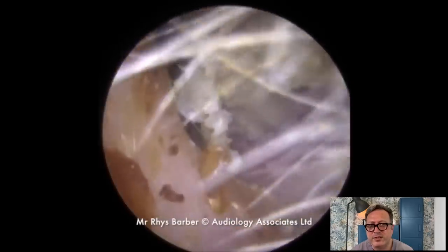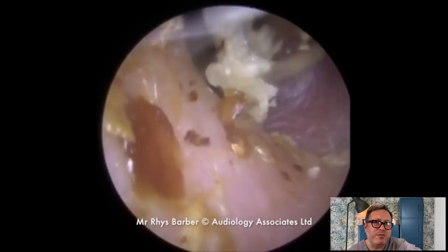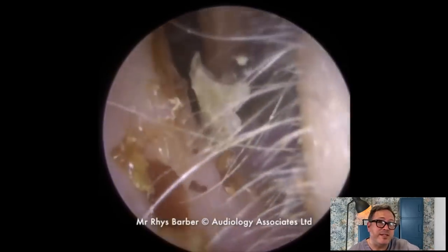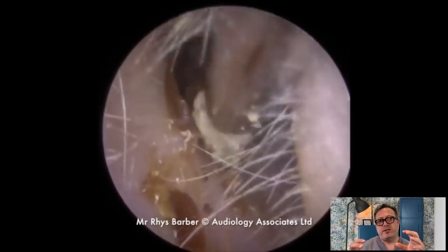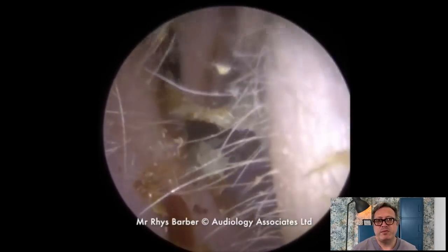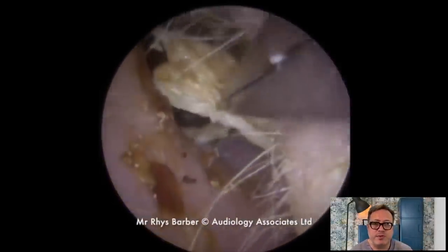You do get quite a lot of degradation to the skin around that area. It looks like it's not too bad there, looking underneath. You can see just how much of that dead skin layer is there — how thick that layer is. The pink is the canal wall itself; the white layer we've just taken away is just dead skin sitting on top of it. But now we've got rid of a lot of this material, it means the natural migration process for the skin can take place again, because we've got rid of that offending thick chunk of skin that's been blocking everything up in there and stopping this migration.